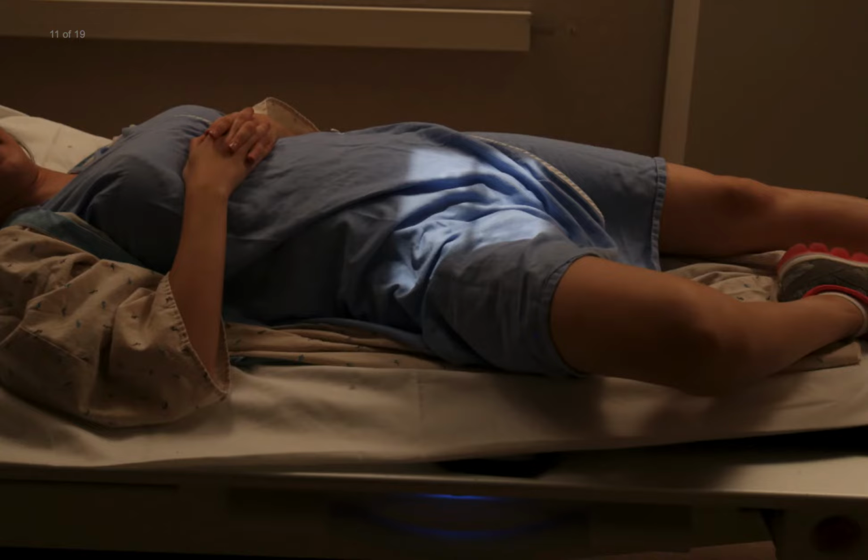Anatomical markers are placed on the image receptor to identify the anatomical side that is being examined. The patient's gonads are shielded, and the shield is placed between the X-ray source and the patient. The patient should be instructed to hold very still, and the exposure is made on a suspended respiration.